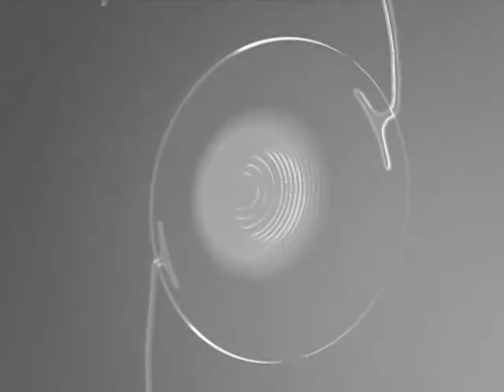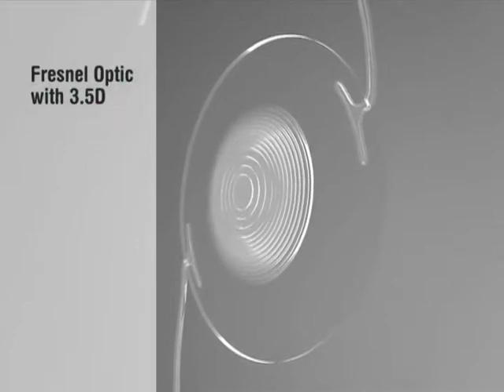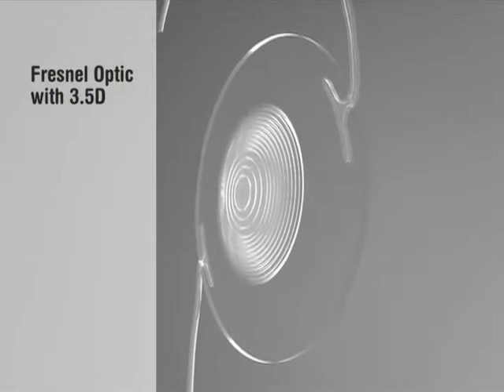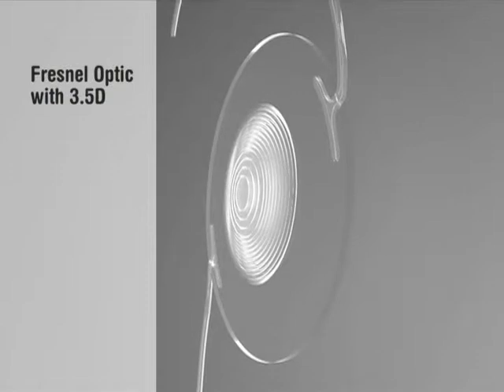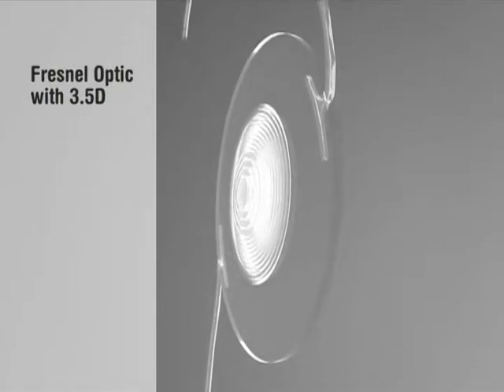Secondly, the add-on has a diffractive element on the surface that provides near vision ability. This Fresnel-type optic has a power of 3.5 D within the eye, which implies a comfortable reading distance for the patient of about 35 cm in front of the eye.